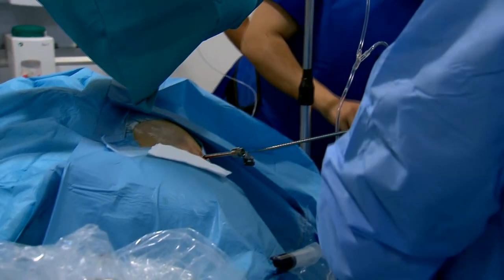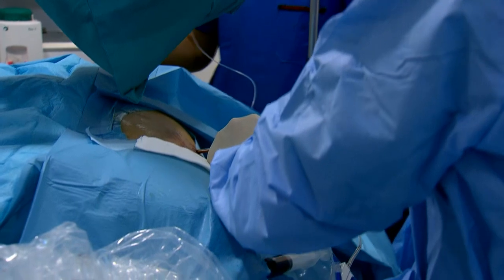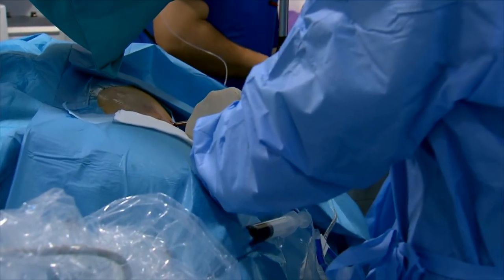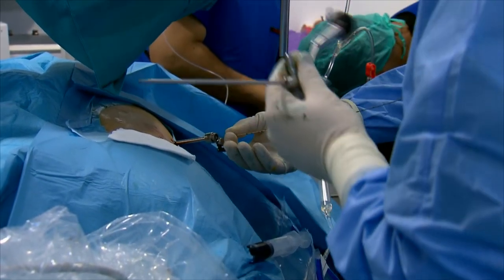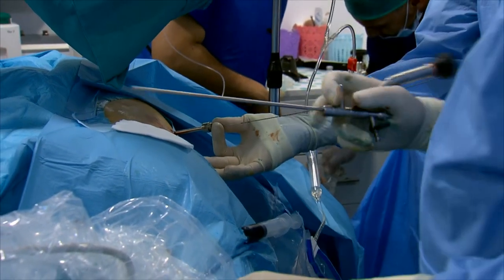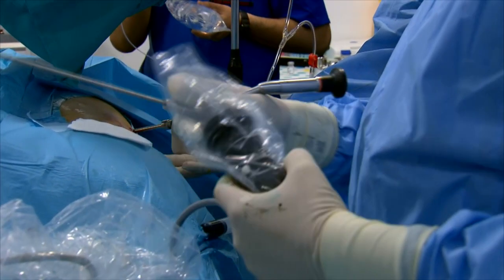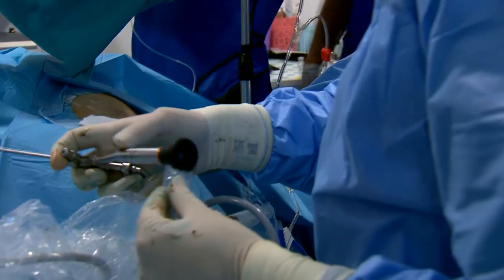But not to remove the guide wire, because we first have a look with the nephroscope. Be careful that it doesn't fall out. A safety guide wire. Just a moment. The next step is to leave the guide wire in place, and to be sure that the placement of the Amplatz sheath is okay.